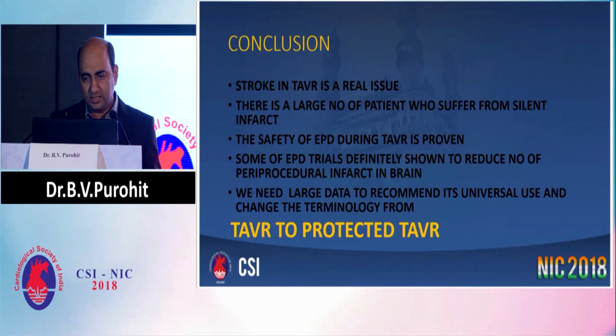So in conclusion, I will say that stroke in TAVR is a real issue. There is a large number of patients who suffer from silent infarct that cannot be ignored. The safety of EPD during TAVR is definitely proven beyond doubt. They are pretty safe devices. Some of the EPD trials definitely showed a reduction in the number of periprocedural infarcts in the brain, but we need large data to recommend its universal use and change the terminology from TAVR to protected TAVR. Thank you.